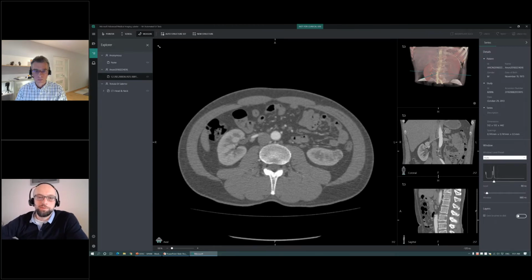What medical science has discovered is that if you target a high dose of radiation at a tumor, then it causes processes that oftentimes result in the tumor receding. And what's interesting is that when somebody goes into a treatment, a physician who understands medicine and anatomy needs to typically tell the machine that will be delivering the radiation where exactly to target. And there are trade-offs because you cannot just target the tumor from any angle. You need to be careful not to hit vital organs too much, and you need to track how much dose every organ is getting.